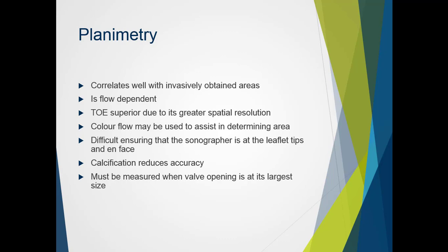Colour flow Doppler may also be used to assist in determining the valve area. It is important to note that colour pixels are larger than those of 2D image ones, so colour overlay should not be used to actually perform the trace itself. There is also significant difficulty in ensuring that the sonographer is actually at the leaflet tips and on face with the valve. Often a degree of tilt and or rotation are applied, and we obliquely cut the valve.